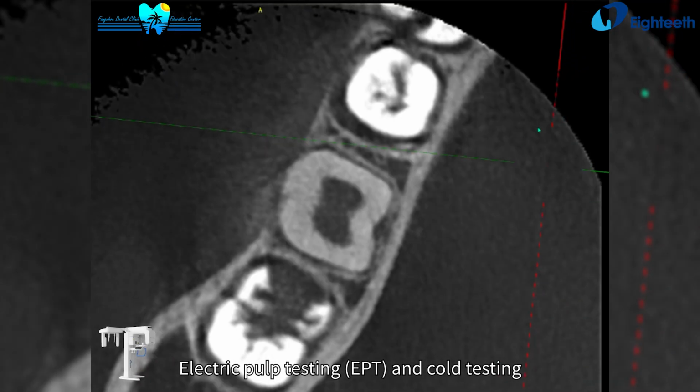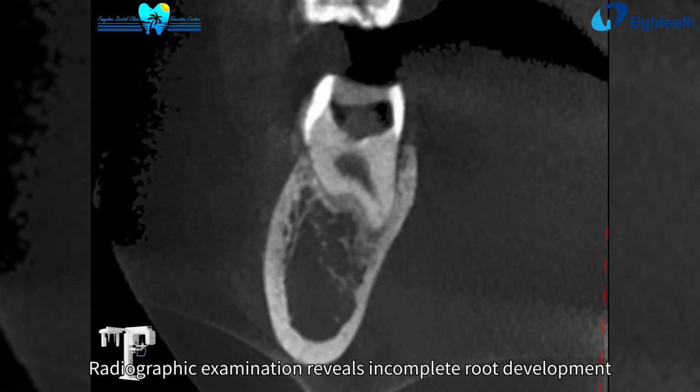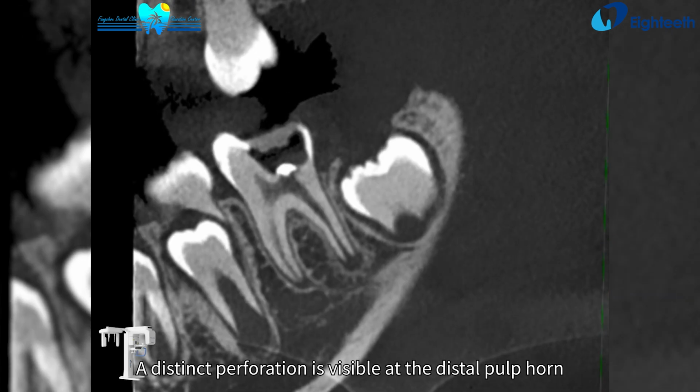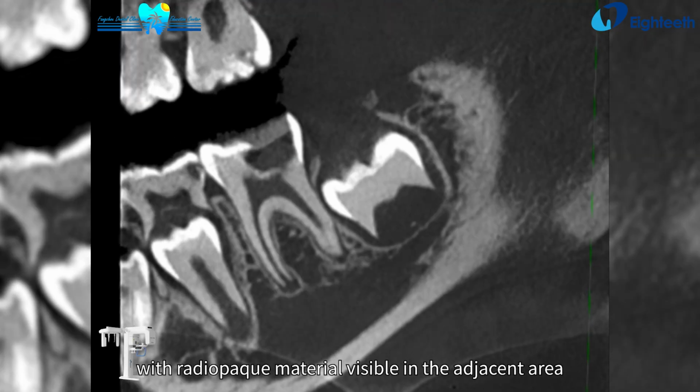Electric pulp testing (EPT) and cold testing show responses comparable to those of the control tooth. Radiographic examination reveals incomplete root development. A distinct perforation is visible at the distal pulp horn, with radiopaque material visible in the adjacent area.